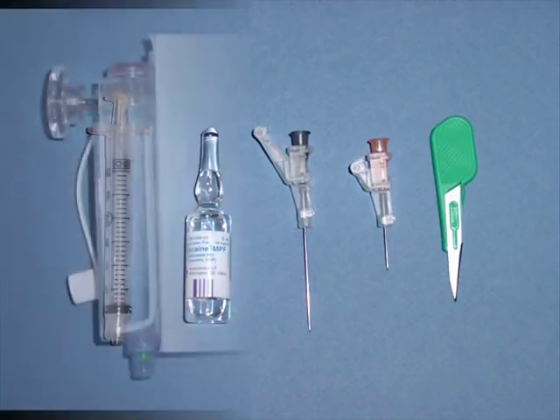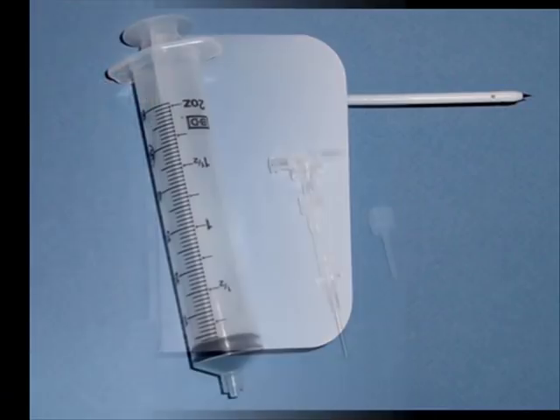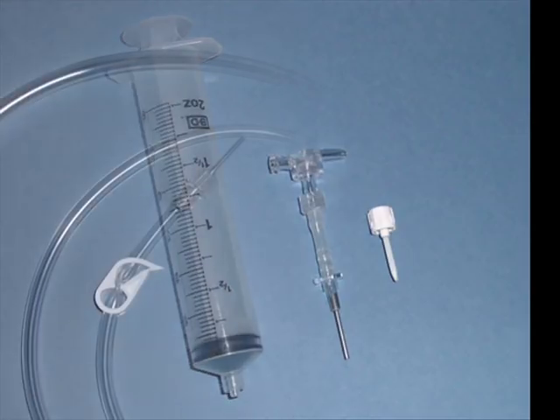Also included are the thoracic vent and trocar, a 60 cc syringe and aspiration cannula and occlusion plug, and a suction tubing set.